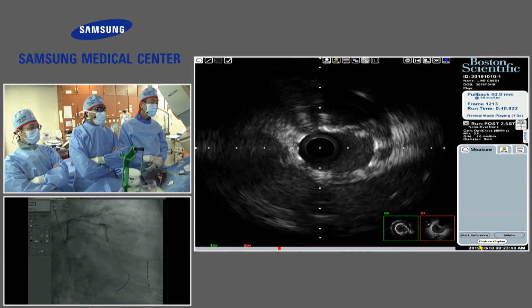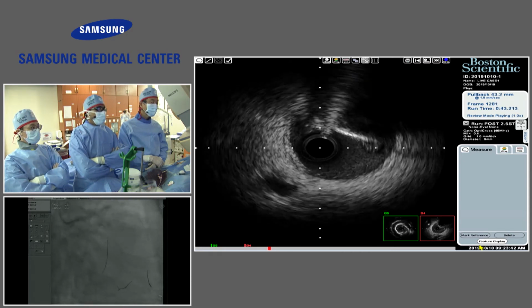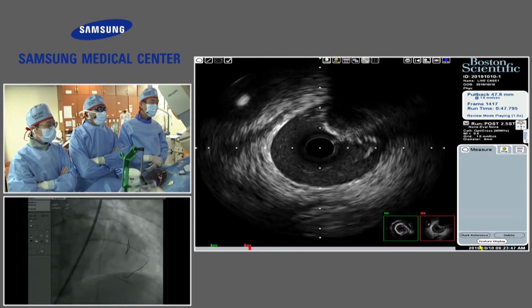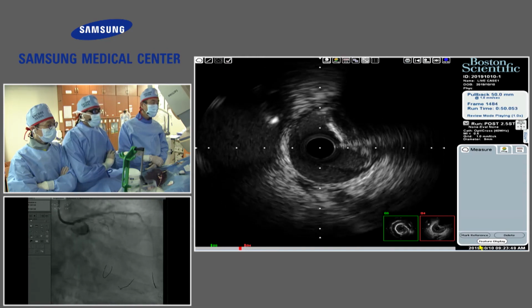Can you all see? Okay. Go back. Further forward. Good. All right.